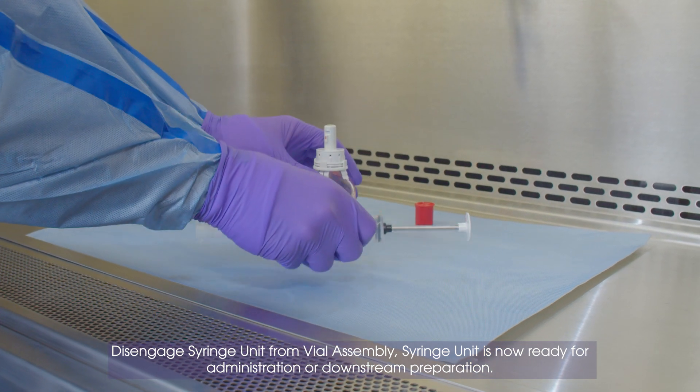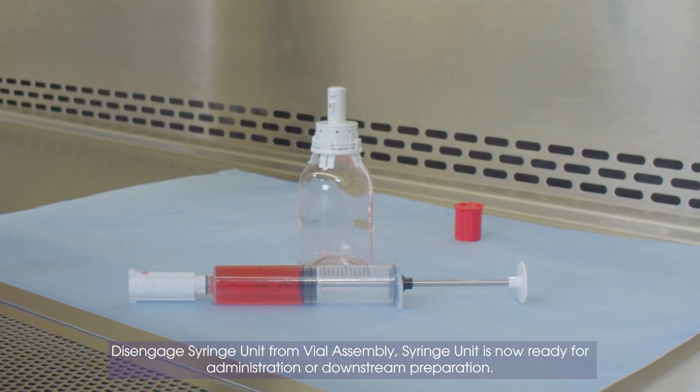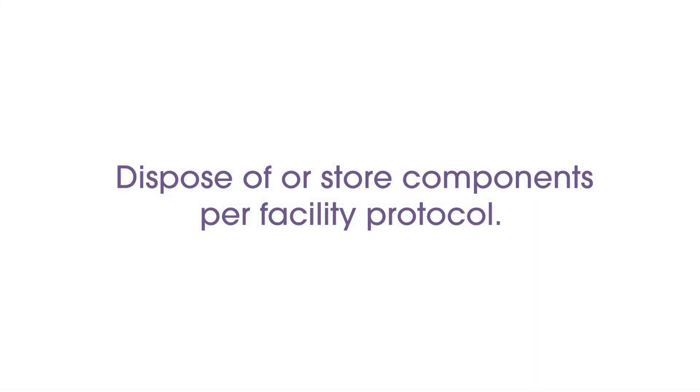Syringe unit is now ready for administration or downstream preparation. Dispose of or store components per facility protocol.